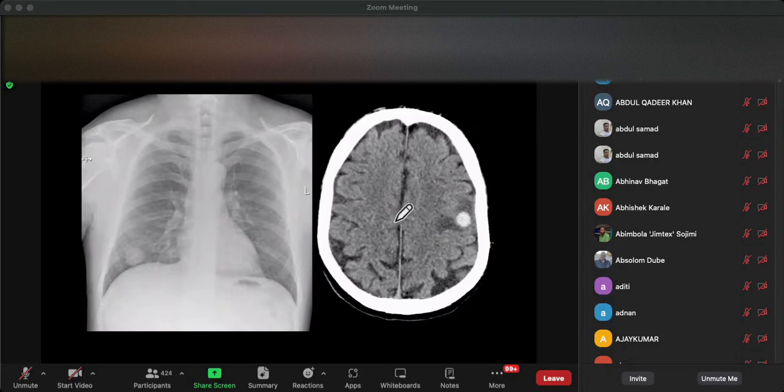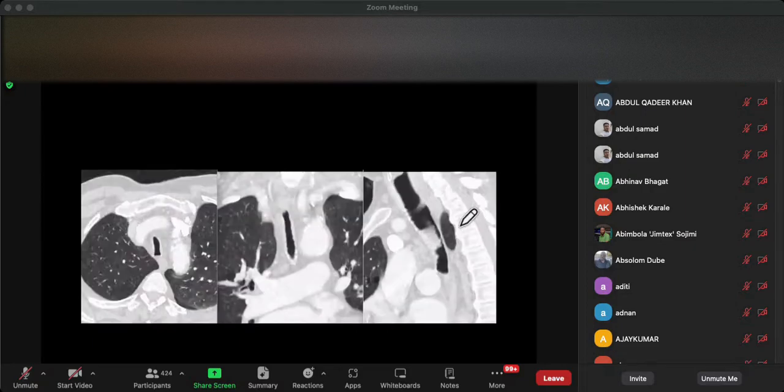Yeah, and we've got melanoma metastases, and the melanoma metastases were due to a melanoma somewhere, could be ocular melanoma, could be on the skin, but the metastases were in the lung and in the brain. And we've got vasogenic edema going up to, but not including the cortex. And this hyperdense metastasis is typical of melanoma.